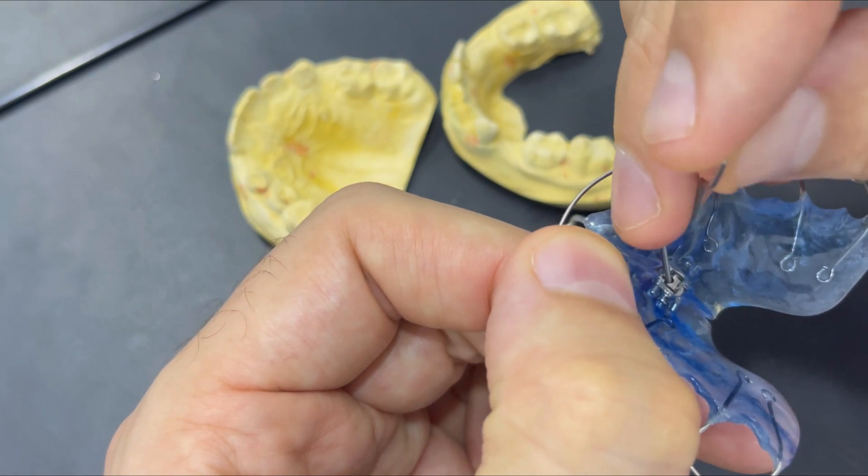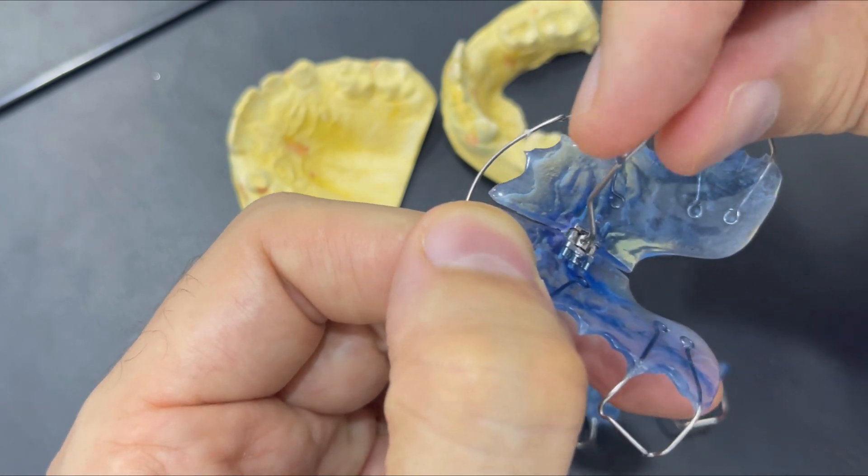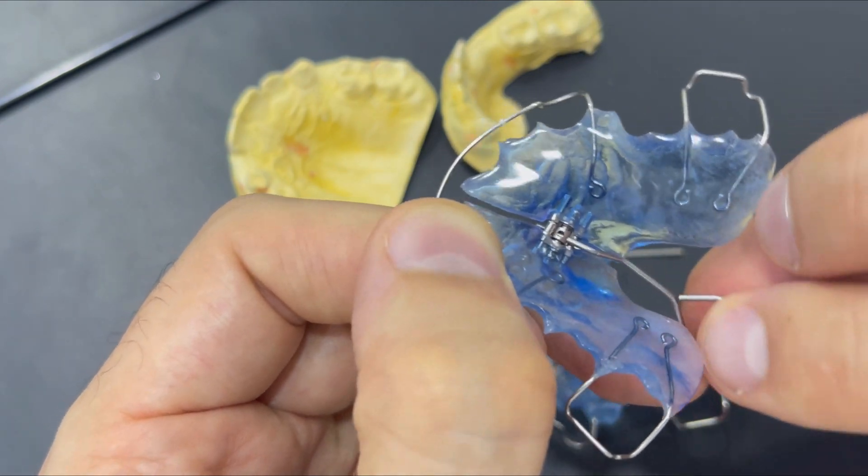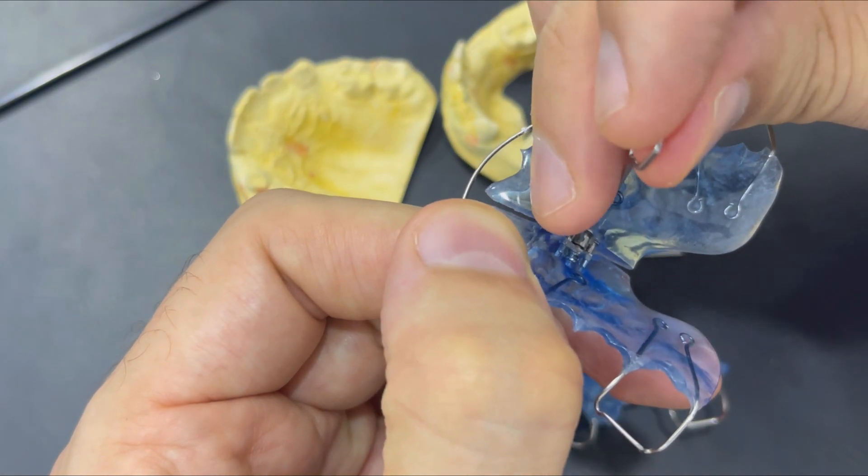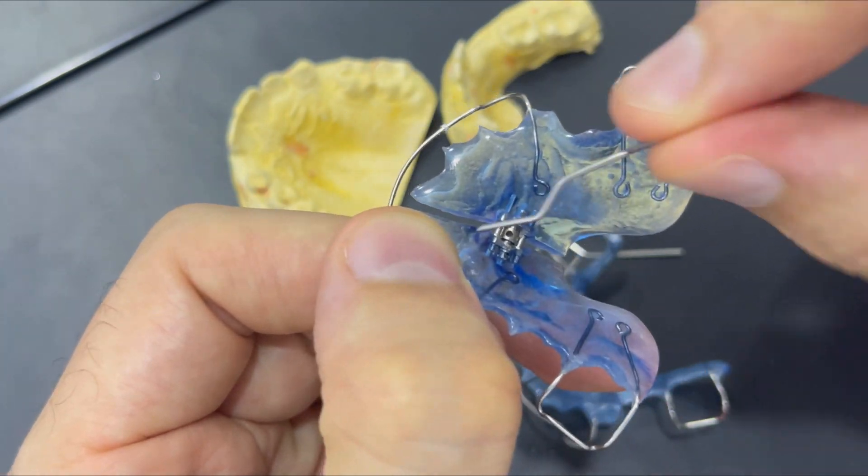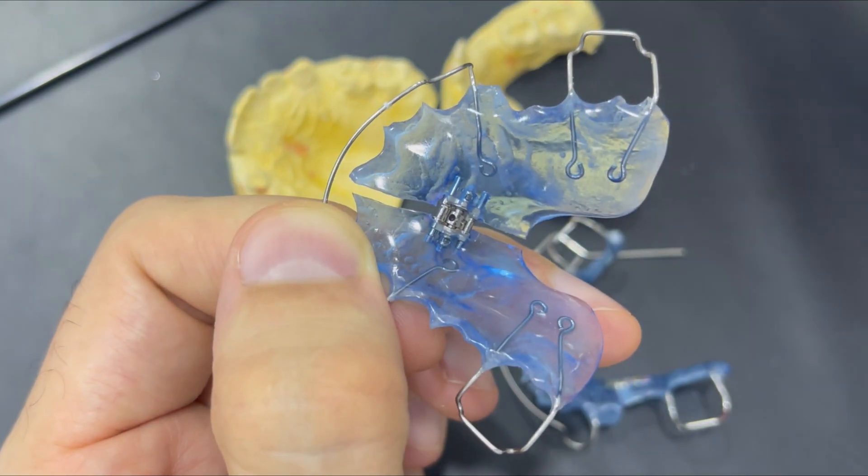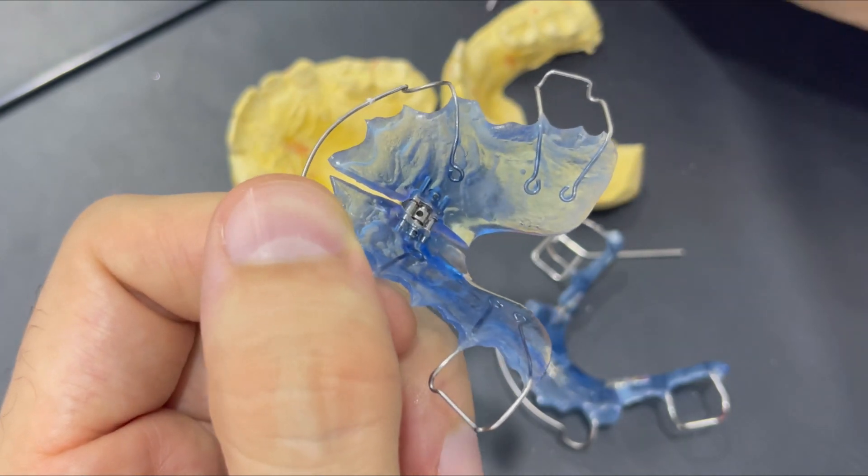For the maxilla, it's preferred to do one turn per week to give a chance for more skeletal expansion. The more we turn the device over time, we should see this crack splitting in the appliance, which means we are getting some expansion. Otherwise the screw could be not working.